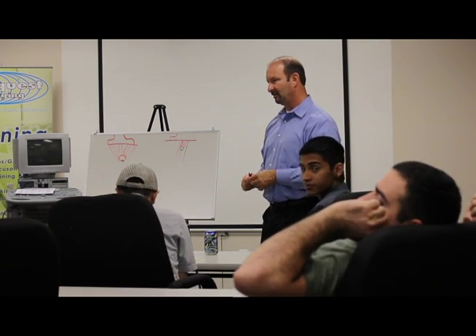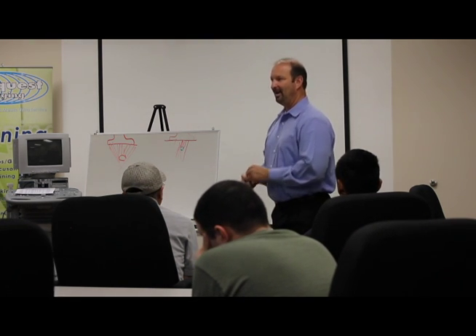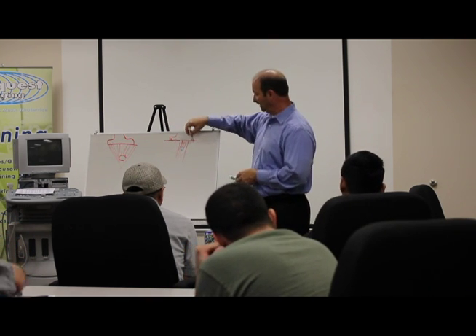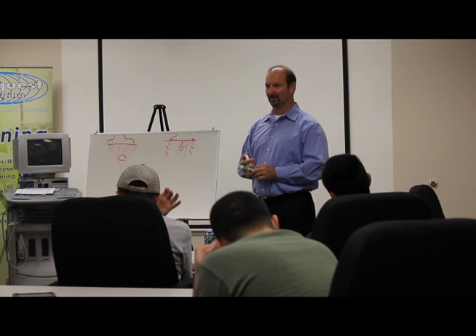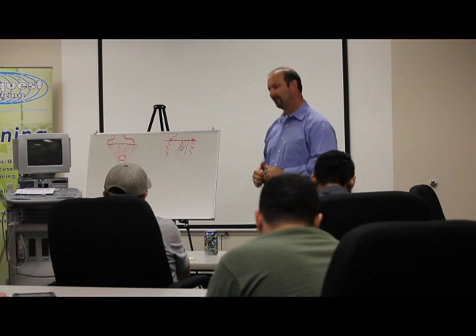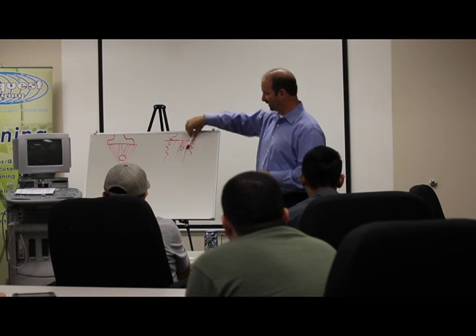Question I have here. On compound imaging, the outside elements being in there, how important is it or is it not? All the elements in the corners, are they dead or not? If you had to, you could operate and get by on a system where these elements were toast. You'd lose the ability to interrogate out here. But they all do play into it. These elements on the outside, for the most part, fill the image on the lateral parts. What about on the compound imaging? On the compounding, it's up to about 7 degrees, I think. If they didn't play into hitting the structure.